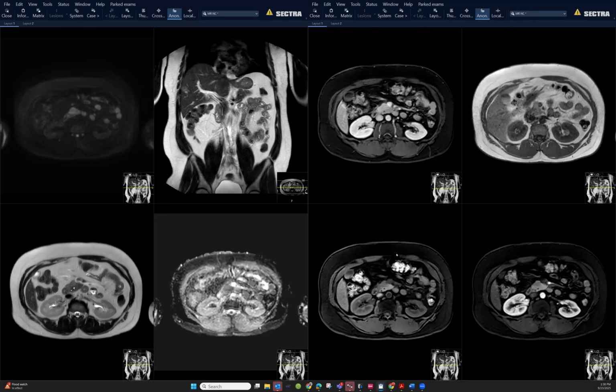So he had an EUS. Before doing an EUS biopsy, they decided to do a PET CT because the other thought was it could be a neuroendocrine tumor, because it's not really doing anything to the pancreatic duct. He's completely asymptomatic, and that scan was negative. I don't have access to that scan either. But basically, he had a biopsy which was negative. His CA19-9 is normal. So my question to you all would be, what would you do next? And I'll tell you what they decided to do.